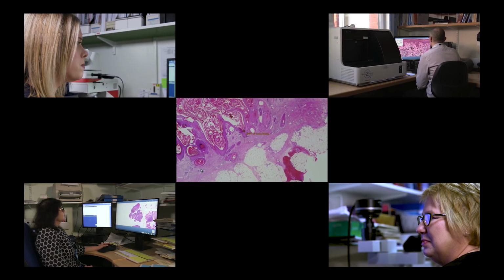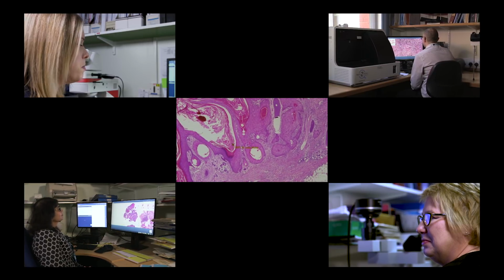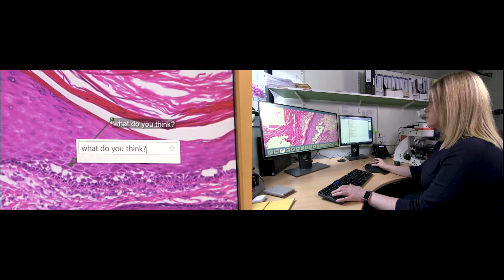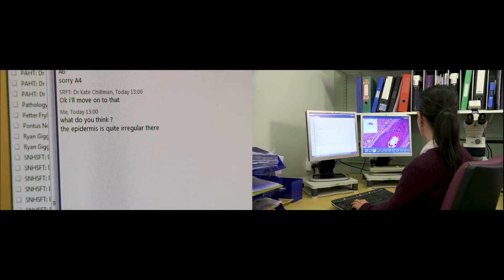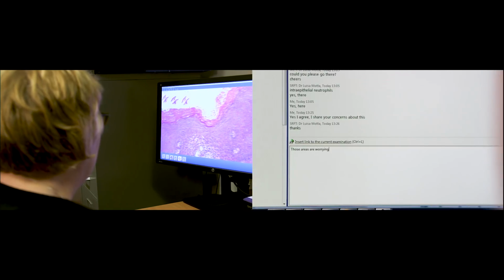So I found that the Digital Pathology project has been very interesting. I think the greatest advantage is the connectivity it can provide. Because the image is digitised, it can be viewed by other people, so if we need a second opinion for a complex specimen, then it's easier to get somebody else to have a look at it, and they can look at it in real time with you. We can get feedback, so not only are we getting better diagnosis, but we're also learning at the same time.